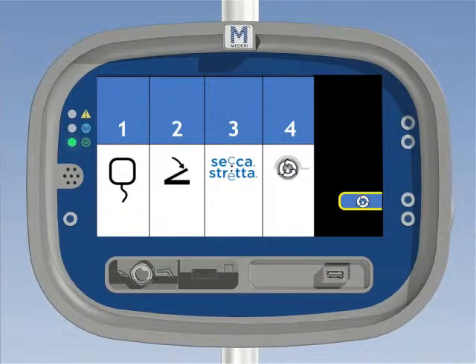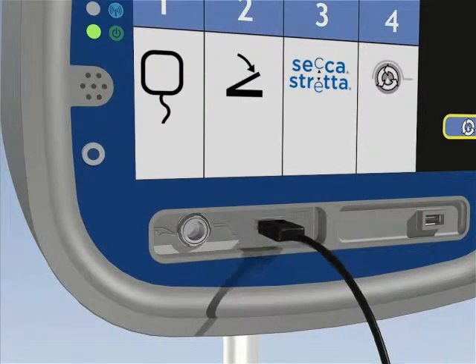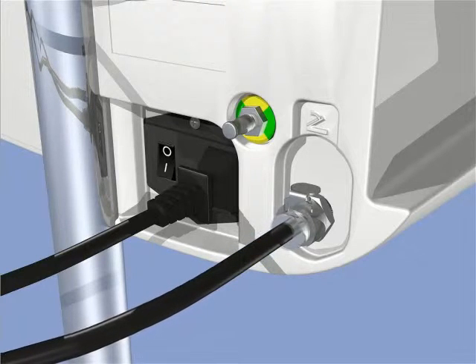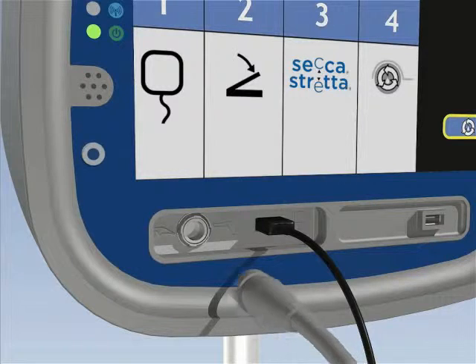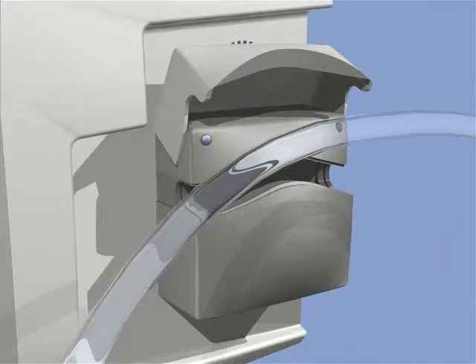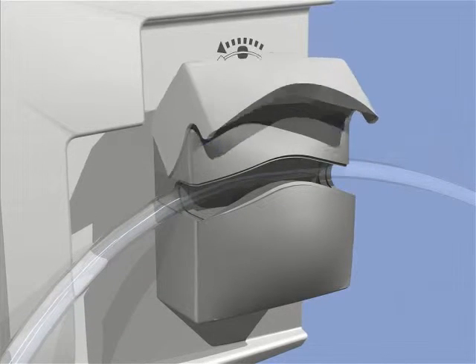Follow the on-screen instructions for connections to the generator. 1. Connect the compatible dispersive electrode pad. 2. Plug in the foot pedal to the back of the generator. 3. Attach the connecting cable to the Secca handpiece and connect to the generator. 4. Place the irrigation tubing through the slot in the pump on the right side of the generator.